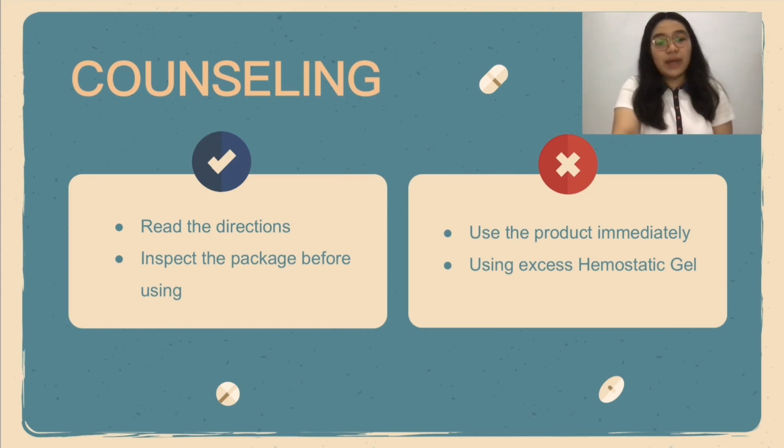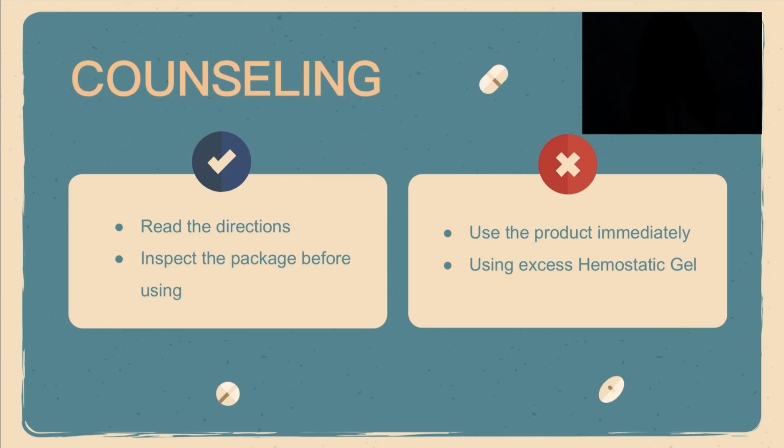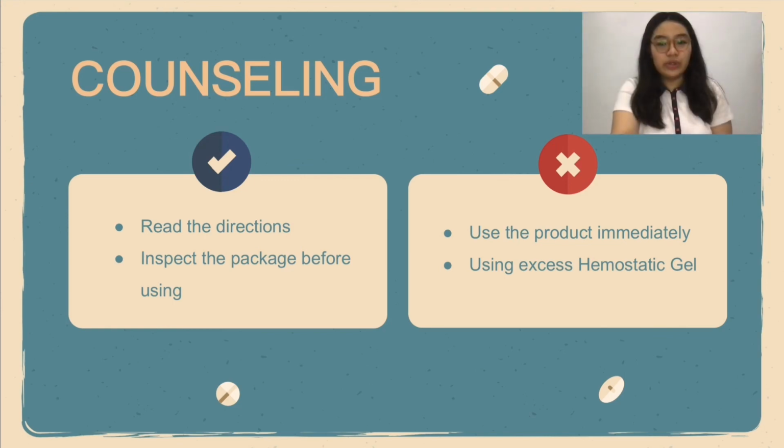Next is inspect the package before using. We need to inspect the package to make sure that the device does not have damage. When the package is damaged, sterility is not assured and therefore the contents of the gel must not be used because it may cause harm.